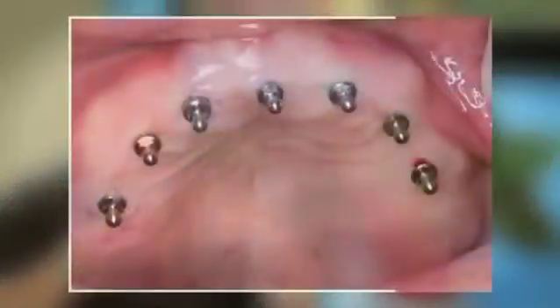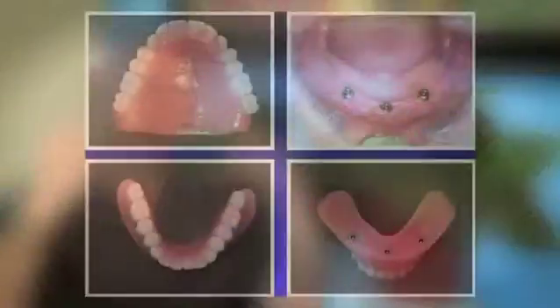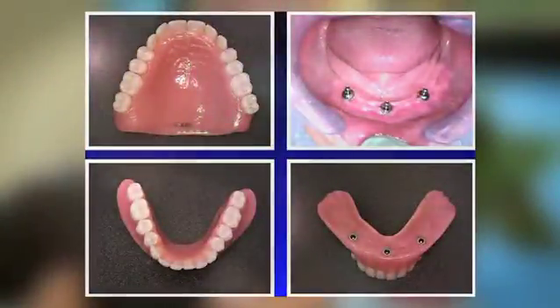But with the advent of implants, we have a much better way of doing this. Generally now, with most overdentures, what I would recommend is the patient to have some implants placed in their mouth, and then we basically add an attachment onto the implant, an attachment into the denture, and then the denture just snaps down and locks onto those attachments, and now the patient has a fixed type of appliance that they can eat on. It's not going to come bouncing out of their mouth, and it's all the difference in the world.